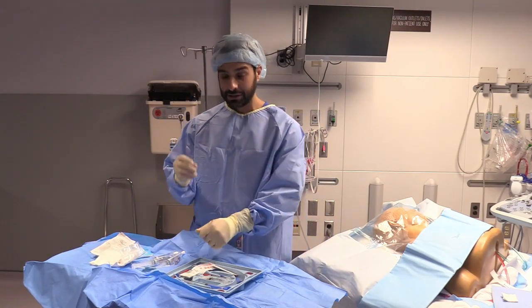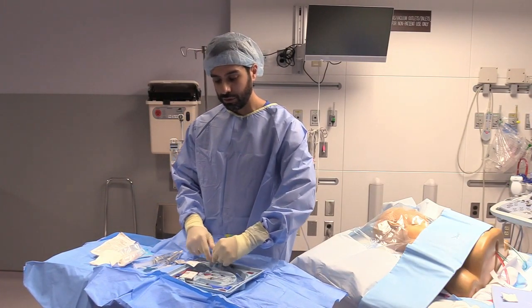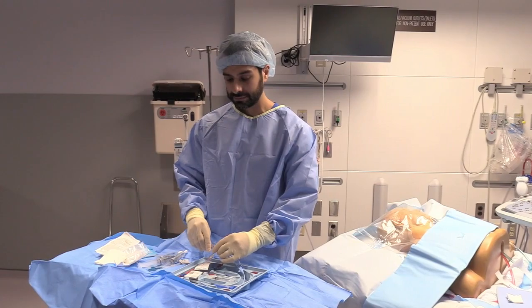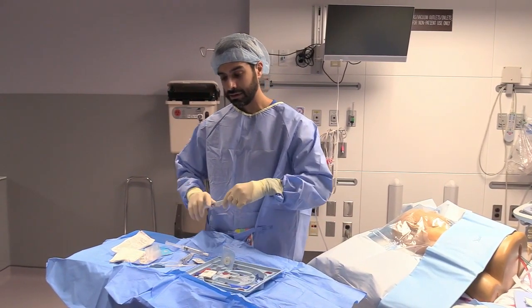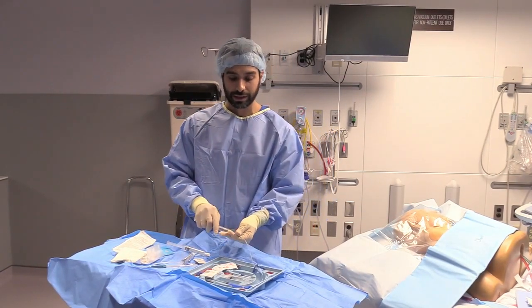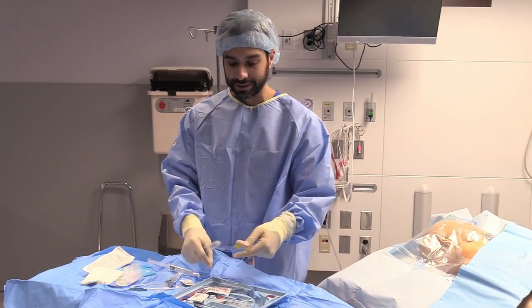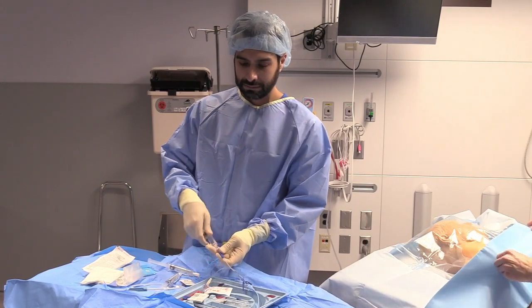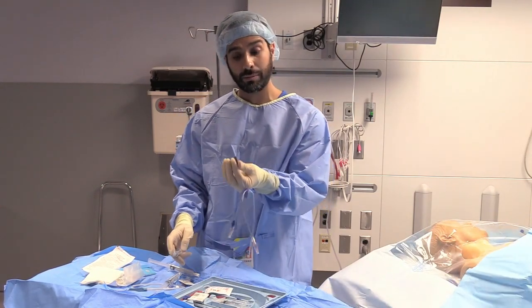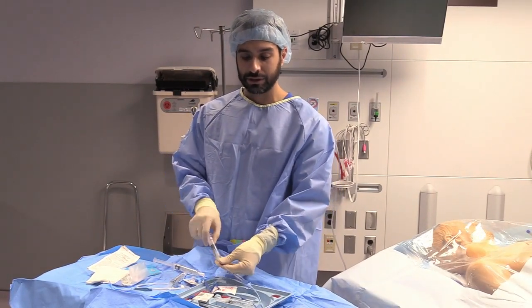The next thing I'll do is I'll take my two caps and I'll put them on my blue and my white ports. Remove the old plastic caps that are there. And then I'll flush the ports so I clear any air out. Not everyone does this. I do this every time, so I flush it so that there's no air inside the port itself. I'll flush the brown port as well, but leave that open because that's where my wire is going to be coming through. So the brown port will be flushed, and I'll leave this open.